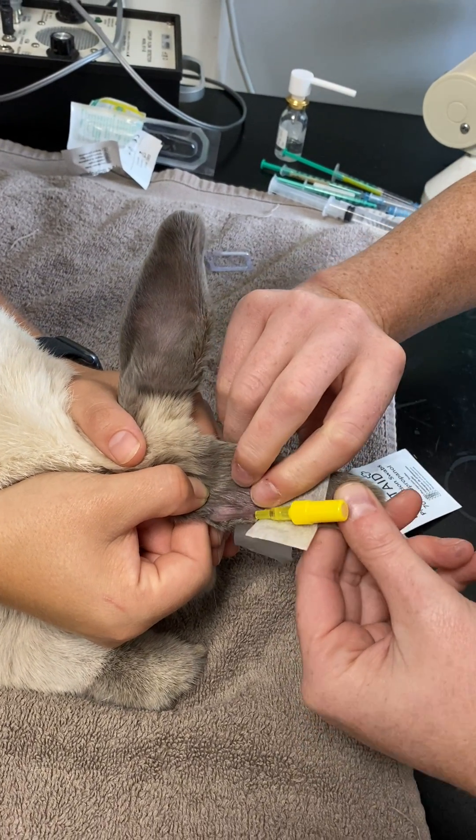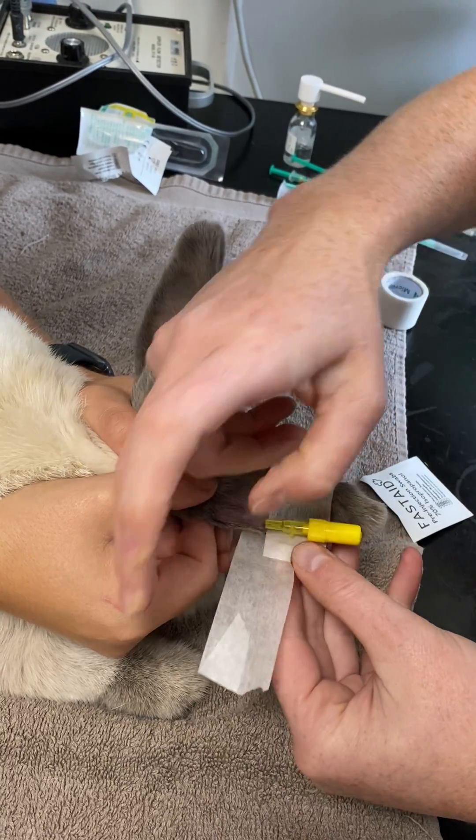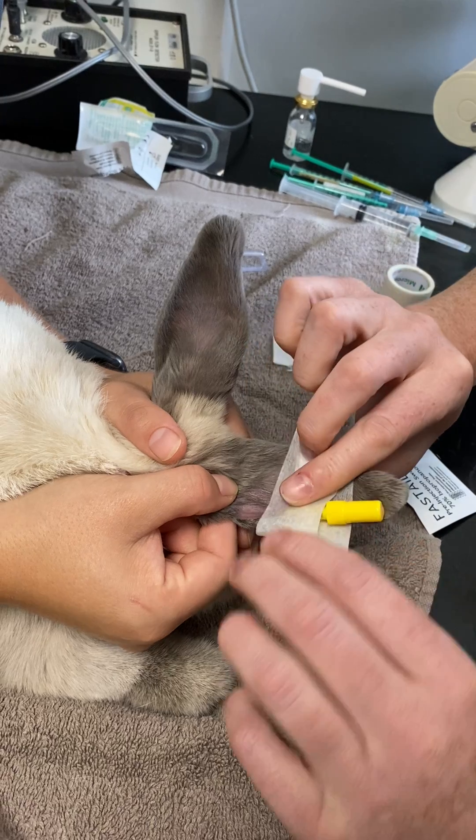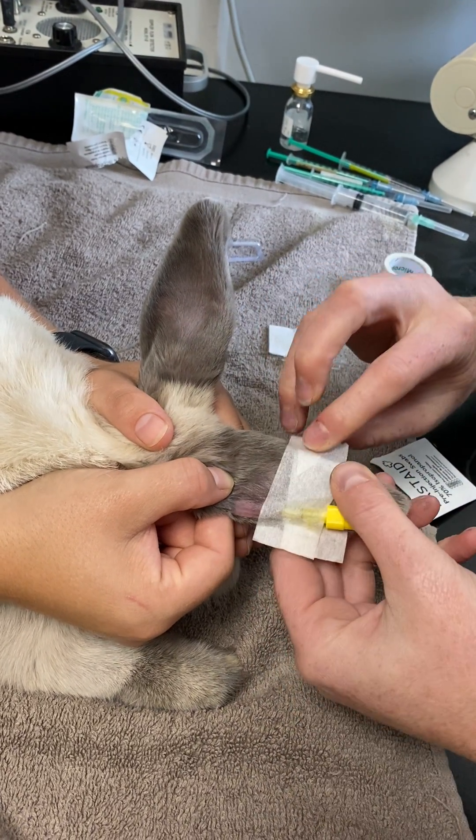You just want to sit it in its natural resting position and wrap the tape around once. Then place that over the top of your cannula and use the tab that you've just created as almost like an anchor point. That's the first bit of tape on.